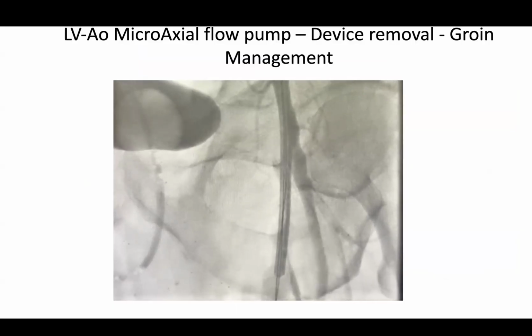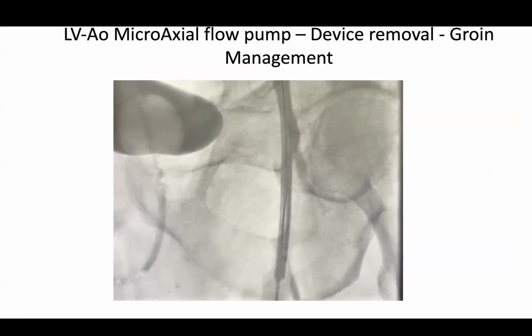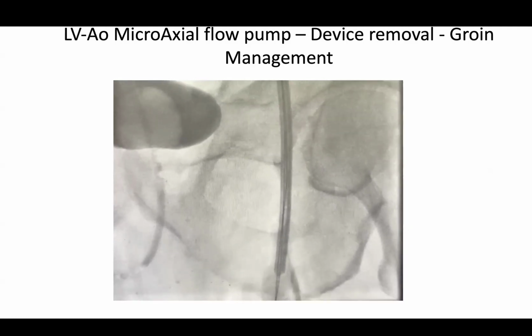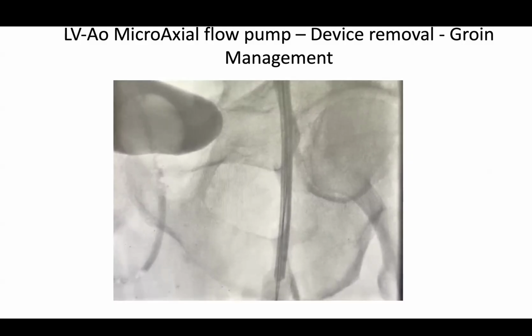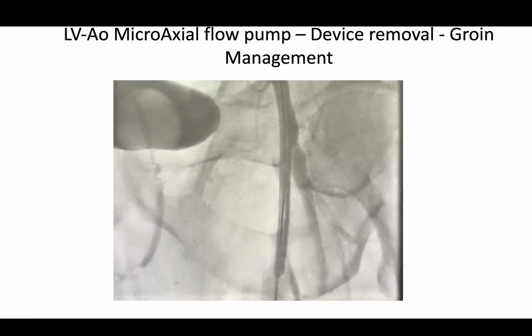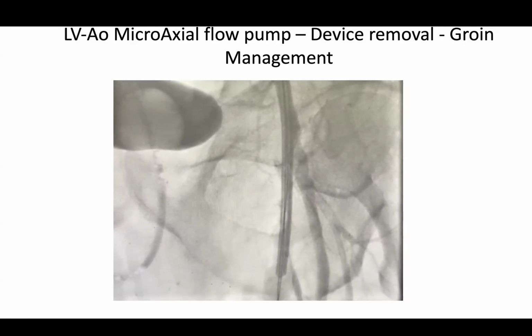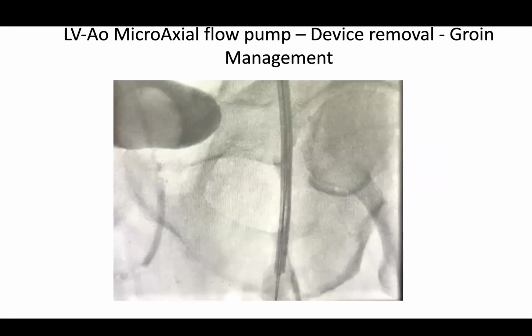This is one of the cases from here as well. So always, once you have the sheath in, just try to document antegrade flow, right? So this is the 14 French. We're just injecting through that, and you can see, it's not the greatest flow, but it should protect you from limb ischemia. And if not, you know where your SFA is, and if you need to obtain a distal perfusion catheter or not. One question for the group.